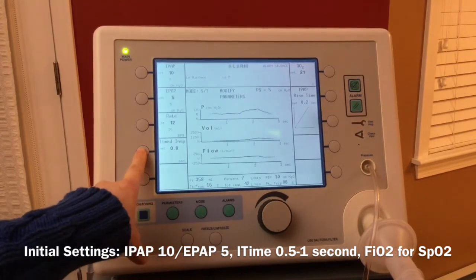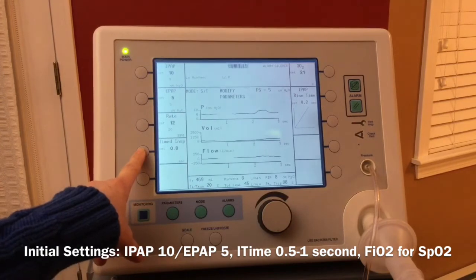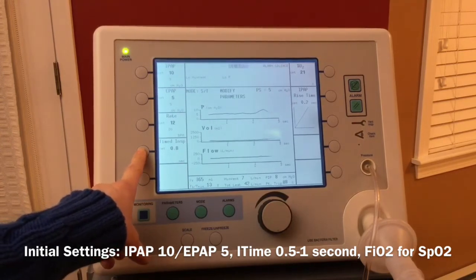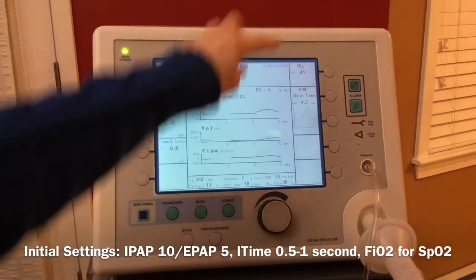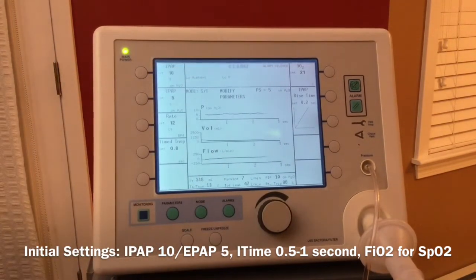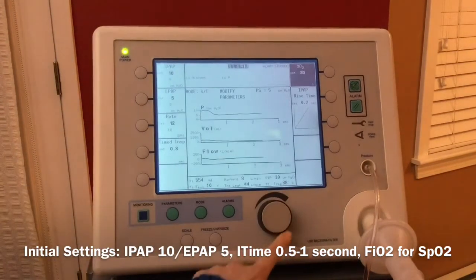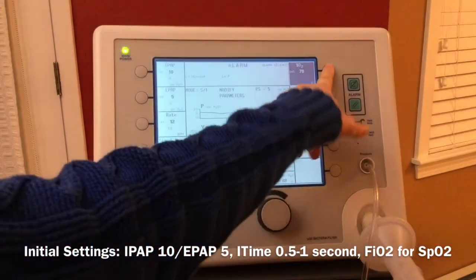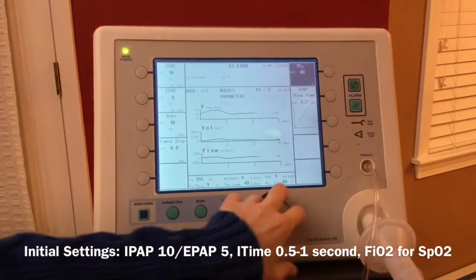Inspiratory time, normal inspiratory time, depends on how fast your respiratory rate is, but about half a second to 1 second. So 0.8 is a very reasonable inspiratory time. We're going to stay on room air because my subject does not need to breathe extra oxygen, but if you wanted to titrate, you would just activate, scroll up, and then change the FiO2. I'm going to put it back down to room air for now.